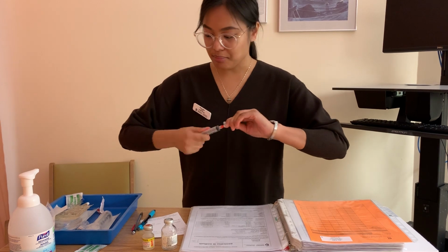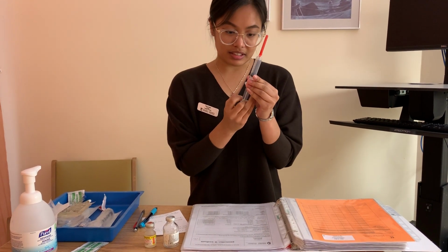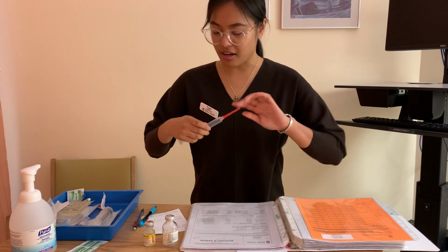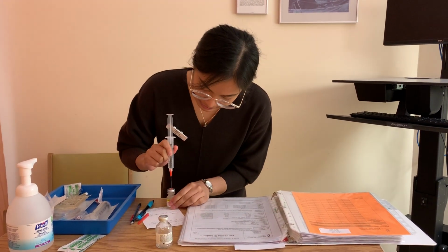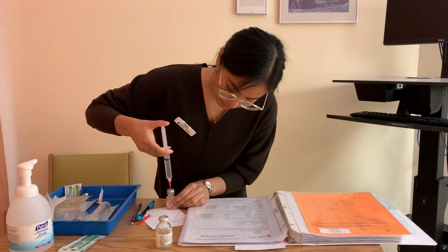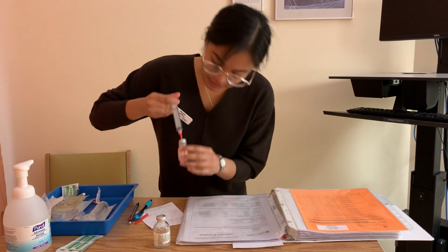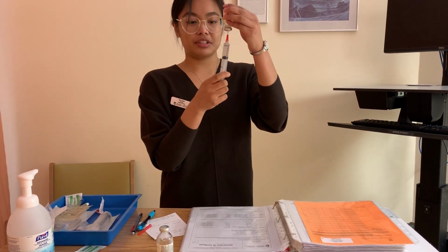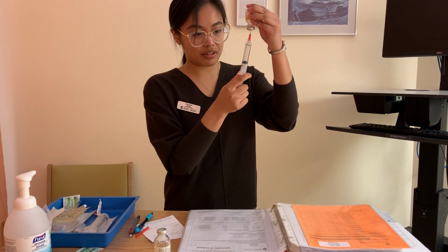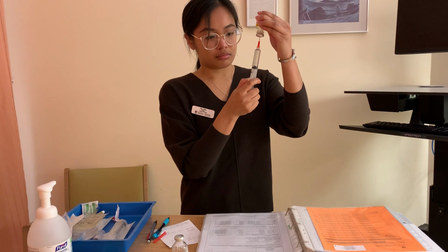And now I'm going to get my 8.2 ml of air. This is to create a positive pressure within our system. So 8.2 of air. And this is still clean, so I'm just going to instill it in here. This makes it easier for me to pull up my medication. So I'm going to get my 8.2, letting gravity do its job. Okay.